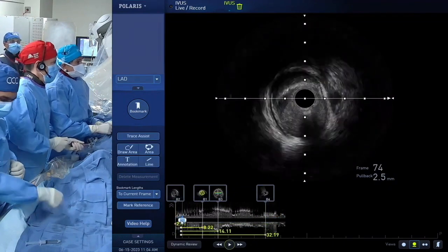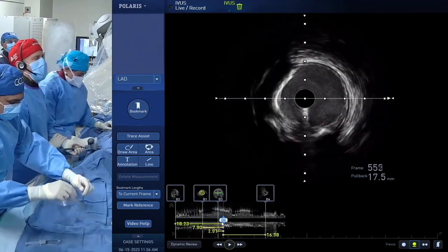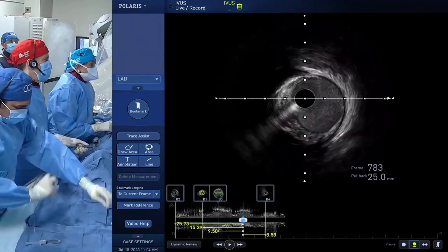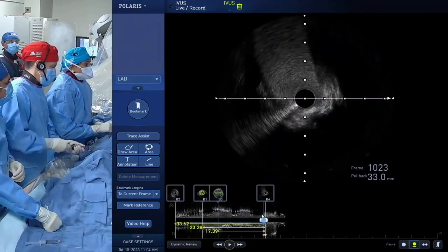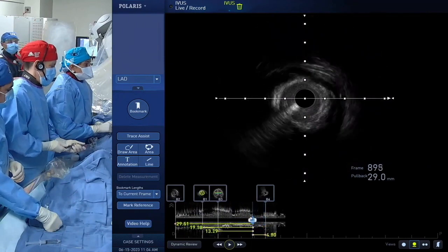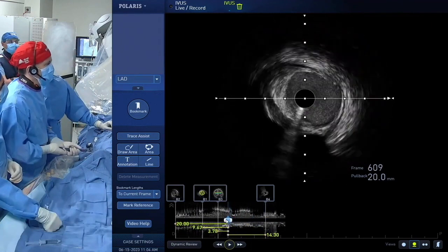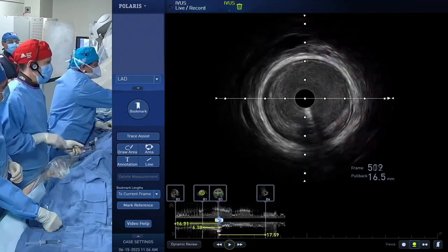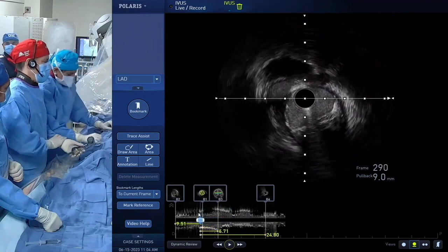La Sala. Yeah, one other thing to consider is when you're looking at a provisional bifurcation like this, you're looking at it from the standpoint of the ostium, right? If it looks really bad, you're going to do an upfront 2-stent strategy. Here, maybe you're thinking it's intermediate. But there's a lot of disease beyond that ostium. And if you put an iFR wire down there, it's most likely going to be positive. So you're committed, I think, to probably fixing that because it's not going to get any better. Yeah, no, I think she's going to fix that.